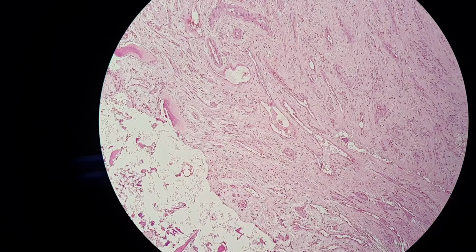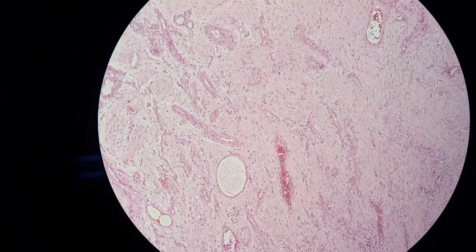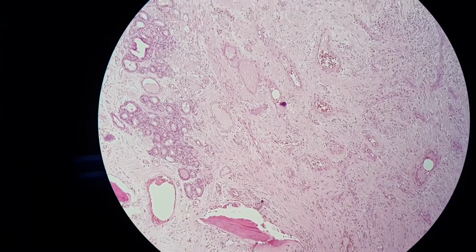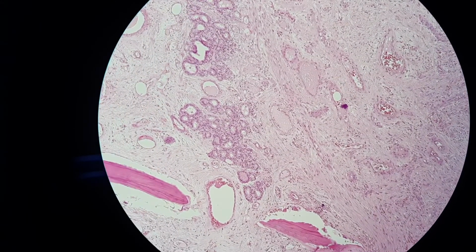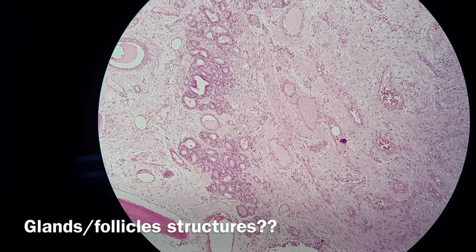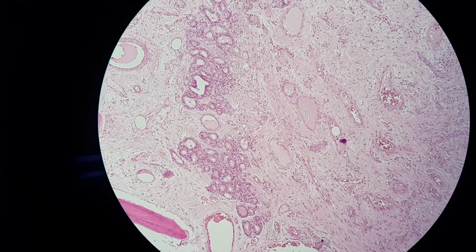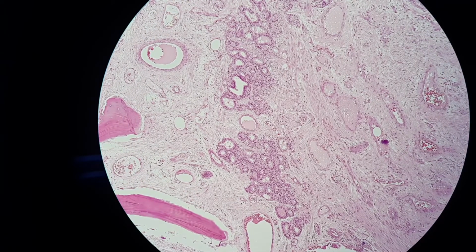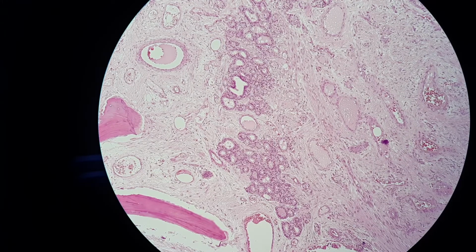And as we go along, within this fibrotic space here, you can see there are some gland or follicle-like structures here. It has a gland-like structure with epithelial cells lining and surrounding it.